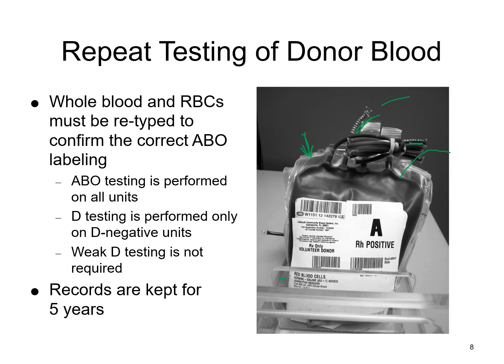And so then you get your red cell product. Well, that tubing where it ran through that leukocyte reduced filter, or whatever tubing where it ran into the actual bag, is sealed off. That tubing has that unique number. All of the additional tubing that was attached to this product has that unique number. And you can see here, this set of segments, I think this is probably the end that comes from the filter. But each of these segments, you can see where they've been sealed off.